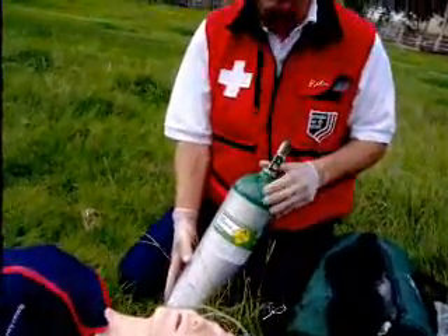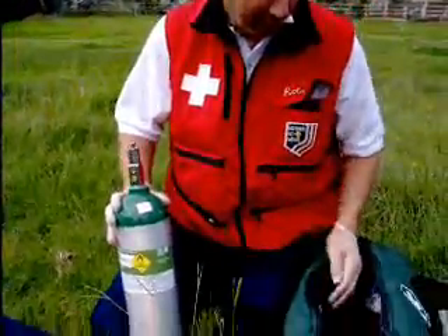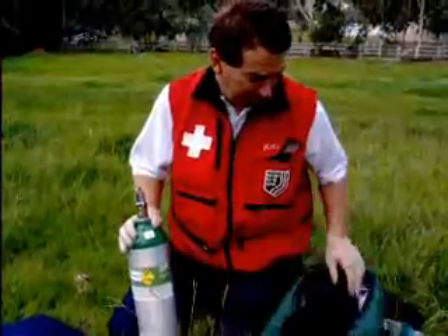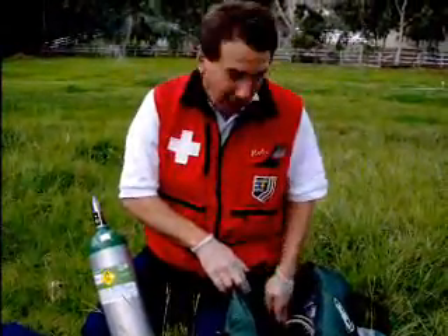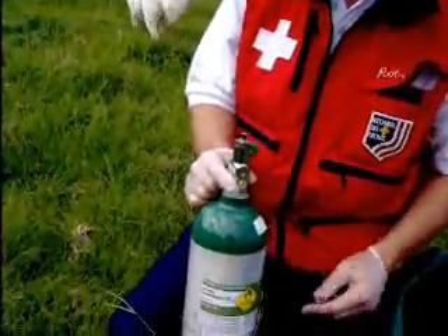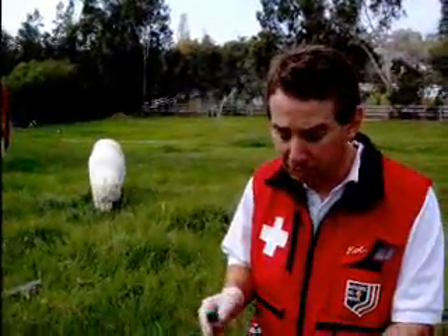This is a D cylinder — the size is a D. Oxygen cylinders always have green on them. This is the most common size. There is another size which is used on the hill and it is a super D. A D cylinder under normal flow will last for approximately 20 to 25 minutes. A super D goes twice as long. There's a third size used in the base room — that's the size E — and it actually has about the same volume as a super D.